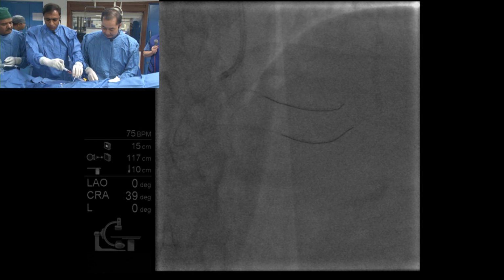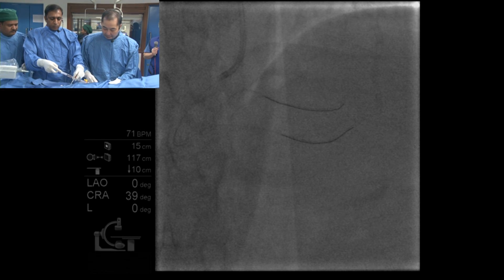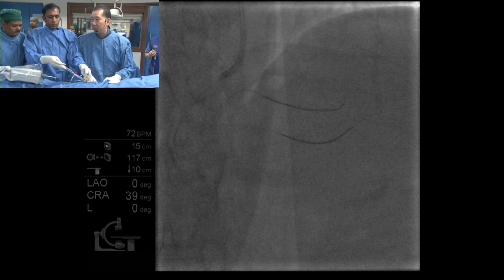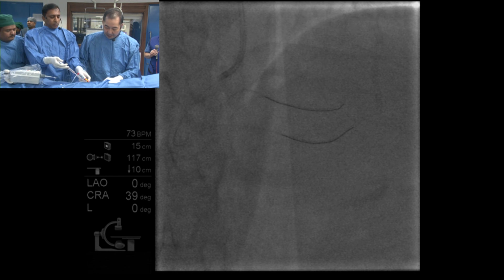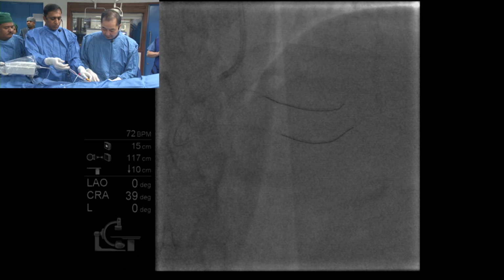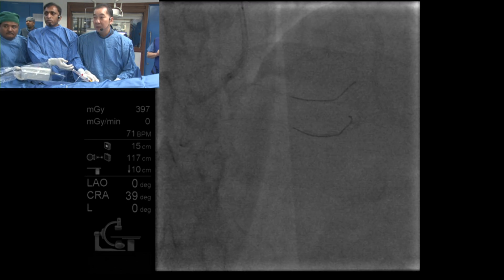How much of your coronary interventions do you use imaging for? I'm using a lot, I think over 80% or 90% in my practice. But my hospital does not use it a lot. Personally, I use it in maybe over 80%.